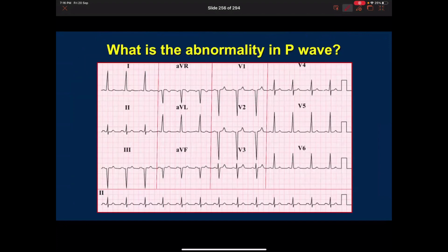Now, can you tell me what do we have here? Left atrial enlargement, yes, why? In lead 2, there is an M notch. Yes. What's the other lead that we look at? V1. What are we supposed to see on V1? Negative. The left atrium should be down. Okay, I don't really see that here. So it's either lead 2 or V1, it doesn't have to be both.